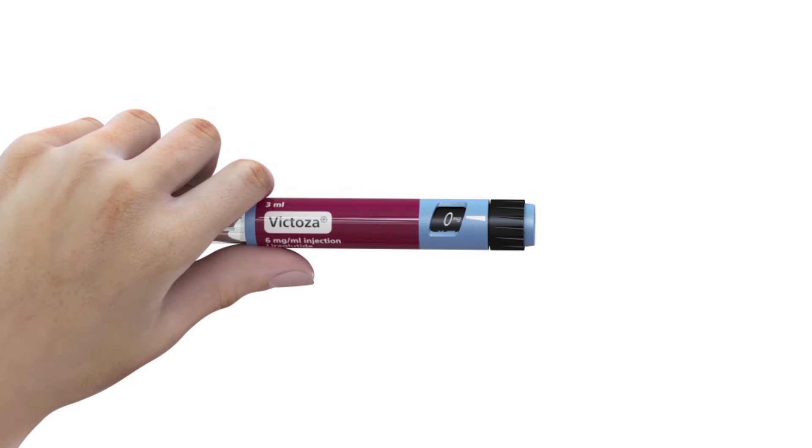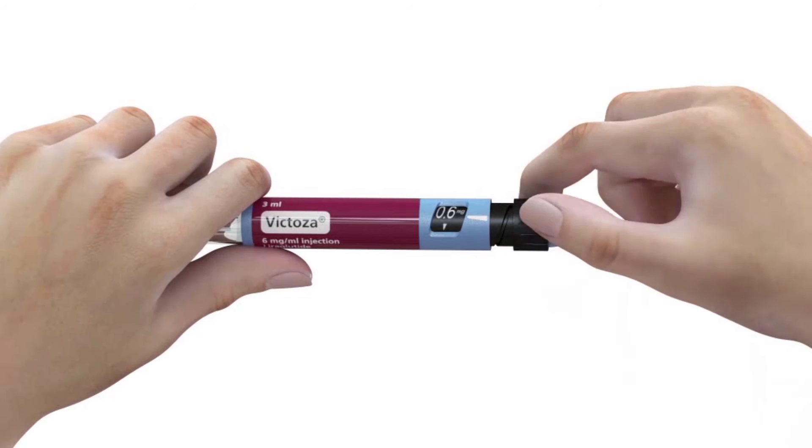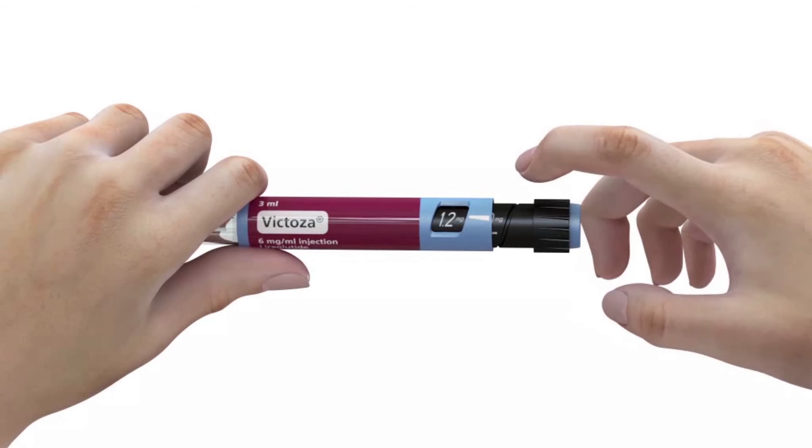Before you start dialing, make sure that the dose selector is set at zero. Select the number of milligrams you need to inject. Adjust the dose by dialing up or down if necessary.